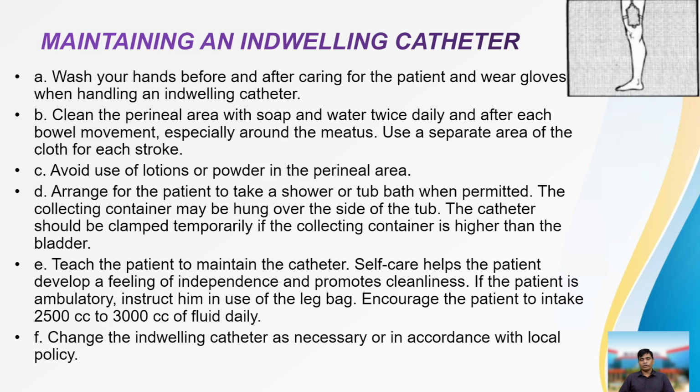If the patient is ambulatory, instruct him in use of the leg bag. Encourage the patient to take in 2500 to 3000 ml of fluid daily. Change the indwelling catheter as necessary or in accordance with local policy.